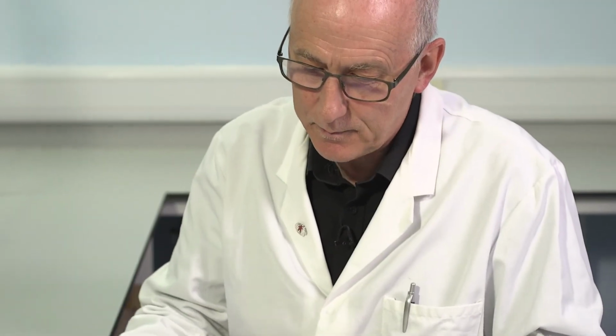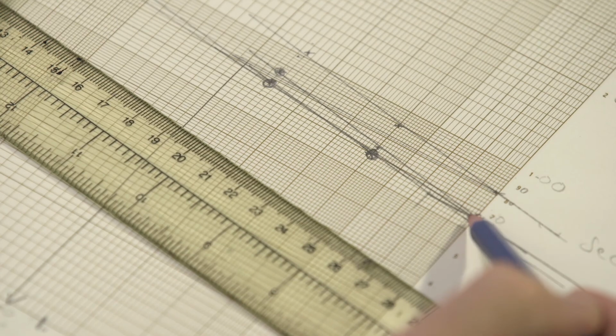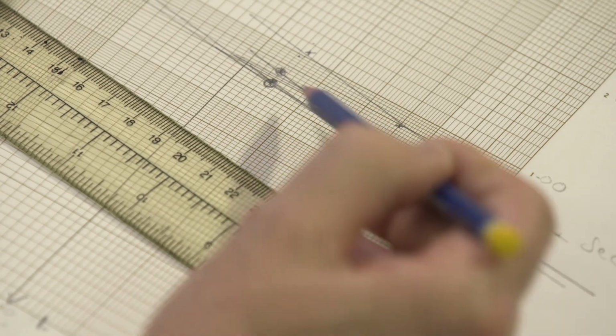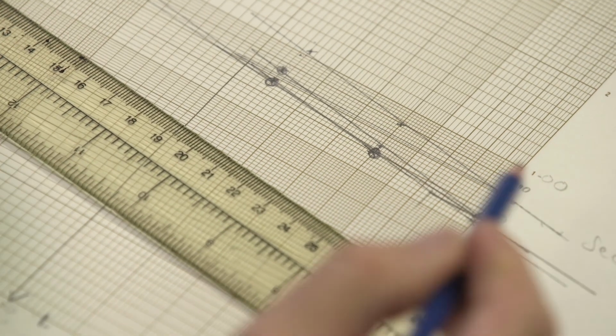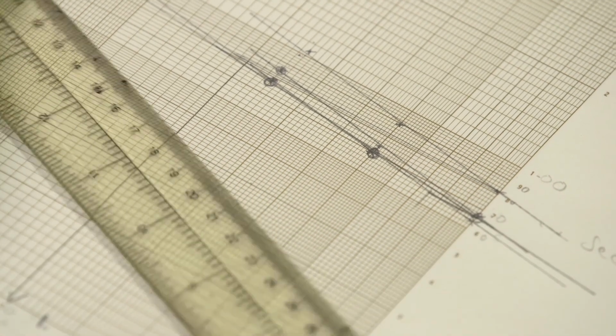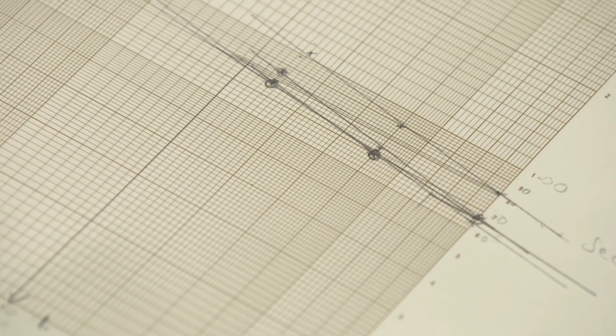It is a straight line, but it's not parallel to the standard. Here is above, and here on or below the line. Straight line relationship, not parallel to the standard. So we have not met the criteria for a valid assay. This sample is a patient who has lupus anticoagulant.